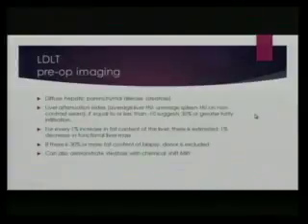Or you can just use the Hounsfield units, but you don't have to get too fancy with that because they're going to biopsy. But for every 1% increase in fat content of the liver, there's an estimated 1% decrease in functional liver mass. So that comes into play when they're calculating how big of a graft to put into the person. Okay. And then you would want to use non-contrast CT, preferably. You can do it with contrast enhanced, but non-con is preferred.